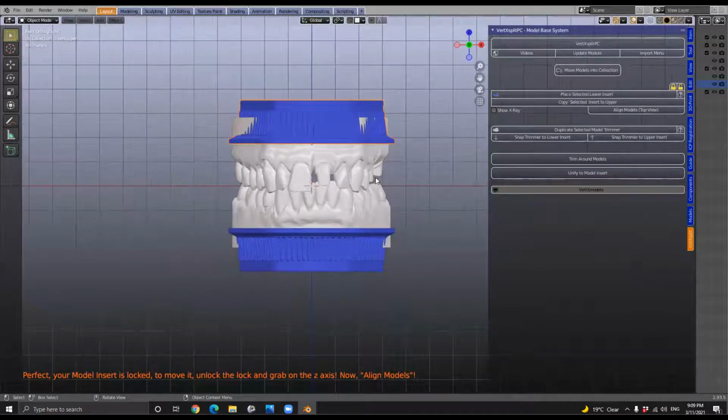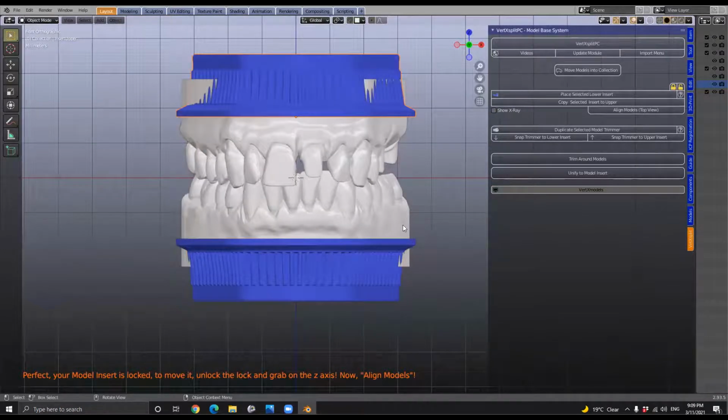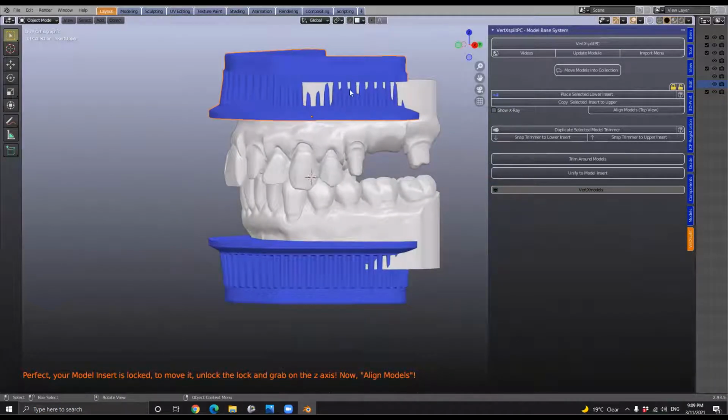Here we go. So these are a standard height apart, so that in the future we can just keep it on the articulator. Every patient will snap into this, and it'll always be the same. No need to articulate anymore because it's all been worked out. Of course now, for example, we may want to move them because we may find the dies are too short or too long. So this is basically the first thing that we do.